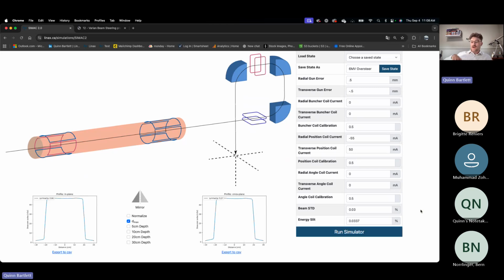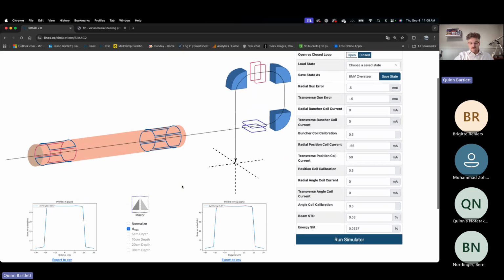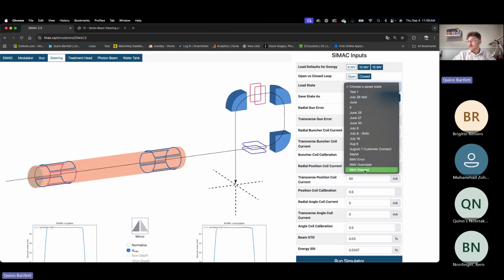So we'll run this, and then we get out, and we're pretty flat here. I could do some more fine adjustments to really see a symmetry closer to 0. But what I'll show you here is the mirror. If we look at our cross plane profile and we mirror that, with those red line errors, it shows you a little bit more that it's not truly flat and that there is that asymmetry involved. So that's great. We'll call this steered, and save it as our steered. So we can save state, just confirm that it's there.